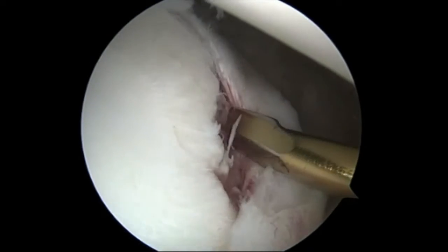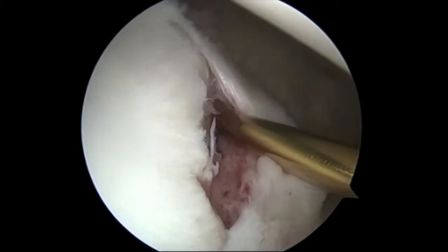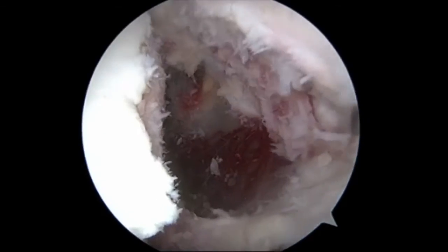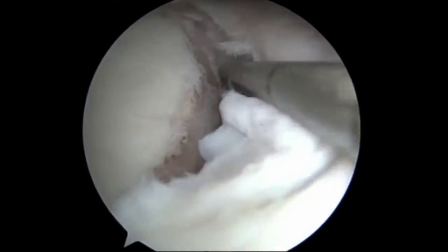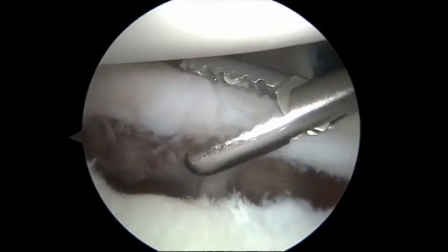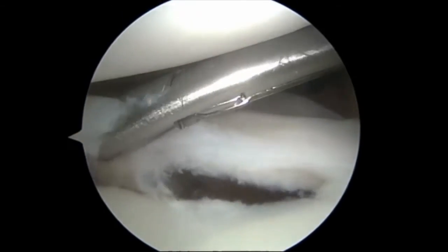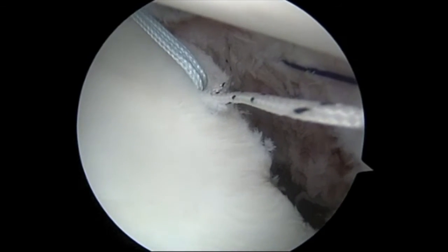We're now going to take one of our elevating instruments to try to mobilize this labrum away from the socket so that we can get it more mobile and be able to advance it up onto the socket. This is all to enhance healing. Now you can see we pull the ligament up now, the labrum attached, and we can advance this to make it more tight and get it back where it used to be.